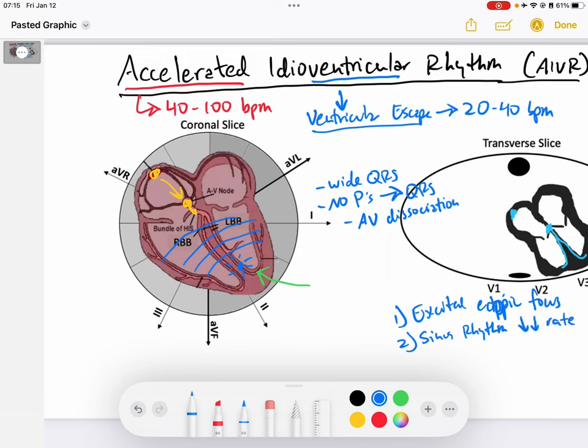If the sinus rhythm, if it decreases in its rate to the point where you have sinus bradycardia at 40 beats per minute, well if that's the case, then maybe this ectopic focus in the ventricle here, it is not being suppressed by normal ventricular depolarization, right?